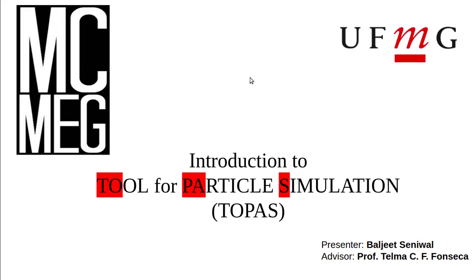Hello everyone. Today we are going to discuss TOPAS, a tool for particle simulation. We are going to see the capabilities of TOPAS, what it can do for us, what is already done, and how you can use it for your usage. I have included one example to show how you can define your own input file, how your code is organized, and how you can use it for your simulation. So let's get started.